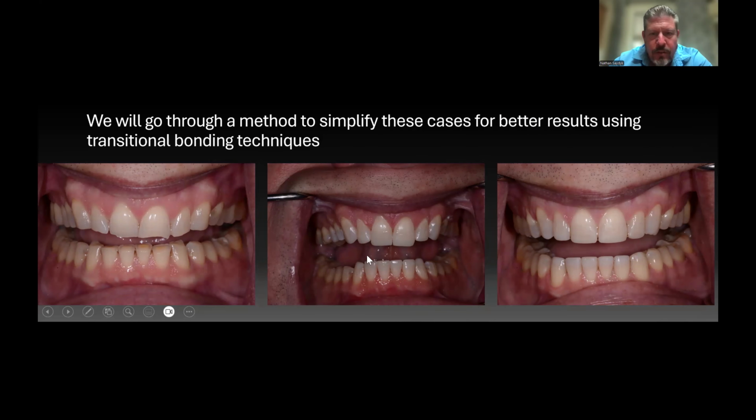We reconstruct those teeth back to the way they should be, and now we have a stepped occlusal plane. And I know what you're thinking. Their bite is screwed. You're absolutely right. I made them way worse. Their bite is messed up, but it's an amazing thing. Once you put braces on people, the bite doesn't matter till you're done. The bite doesn't matter. We're moving things, right?